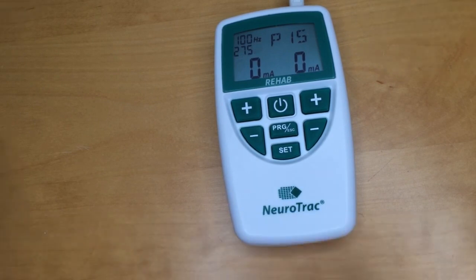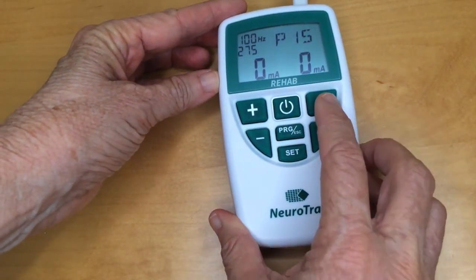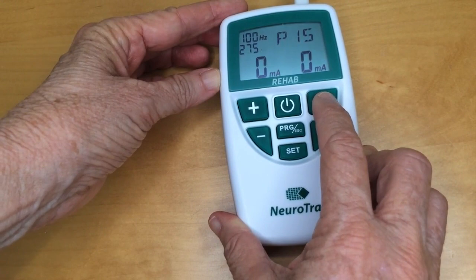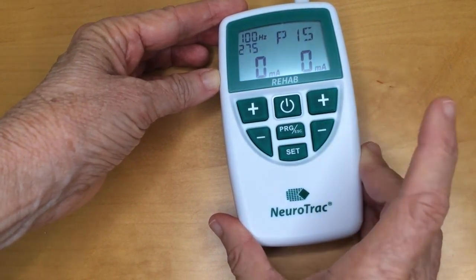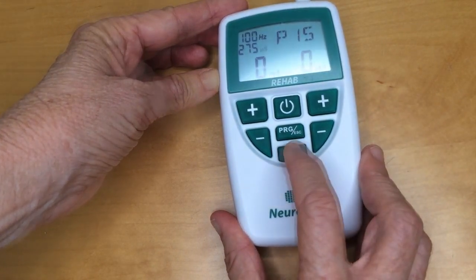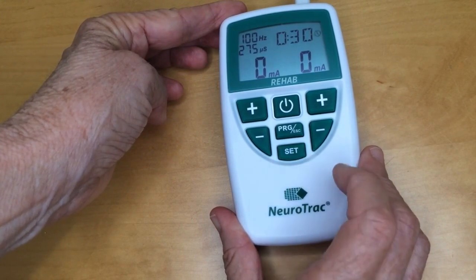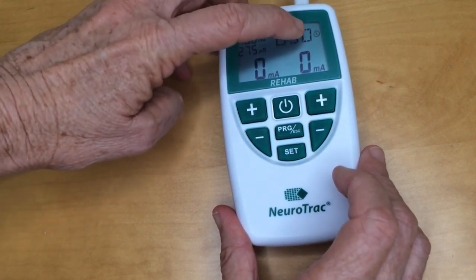Again, use the plus and minus buttons to adjust. Use the plus and minus buttons. When you've got it where you want it, press set and it brings you to the timer, shown in the top right. You can increase or decrease the timer — it goes up to 90 minutes.